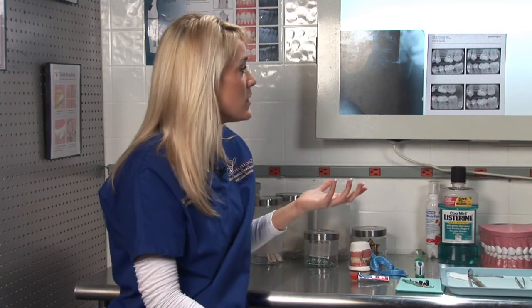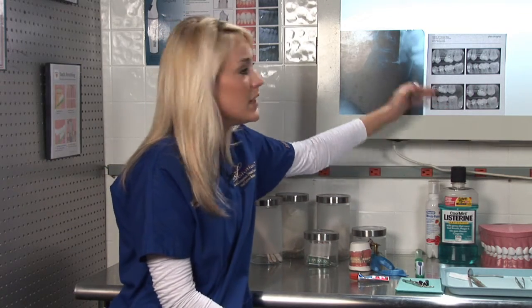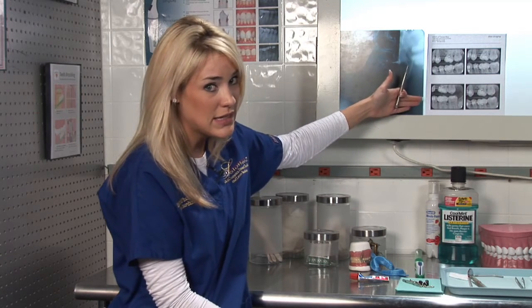The doctor is able to determine if you have any cavities on the surface of your teeth with his instrument, but there's really no exact way to determine if you have cavities in between your teeth unless you have bite wing x-rays taken.